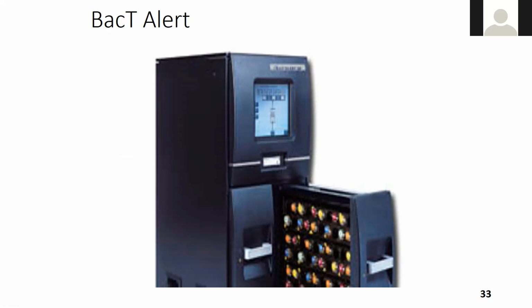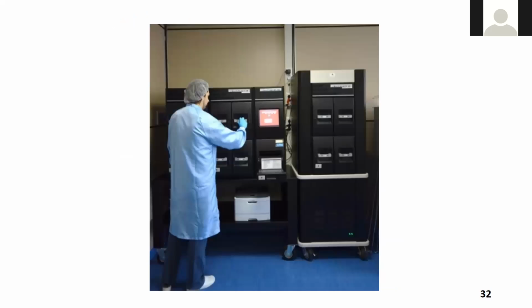Sometimes they'll tell you, hey, nurse, if you draw some, you can just come back here and throw them in there and we'll figure it out later. And that happens. But I was also informed recently that it's actually better not to put them in any incubator until you're ready to put them in here, because you don't want to miss the change, right? If you incubate them without being in the machine, the sensor may not pick up the change in the color at the bottom of the bottle. So that's something to note.